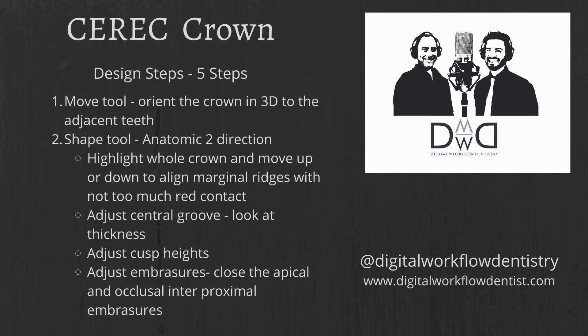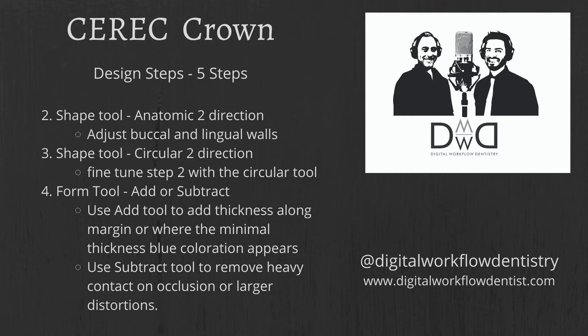In the shape tool anatomic two-direction mode, we move the entire crown up and down to align the marginal ridges. We want to try to move the whole crown so there's not too much red contact. We adjust our central groove to check thickness — with Tessera we want 1.5 millimeters ideally. Then look at the cusp heights, look at the embrasures, and start closing those embrasures both apically and occlusally. Finish the shape tool by adjusting the buccal and lingual walls to proportion them to the adjacent teeth.